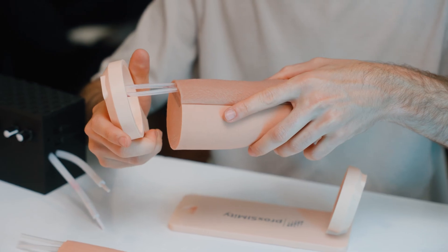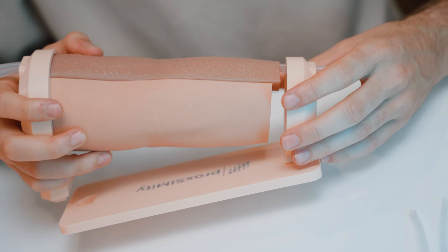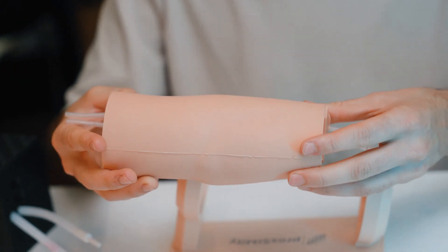We have these replaceable units with different skin conditions starting from healthy, dehydrated, collapsed veins, edema, and even elderly.